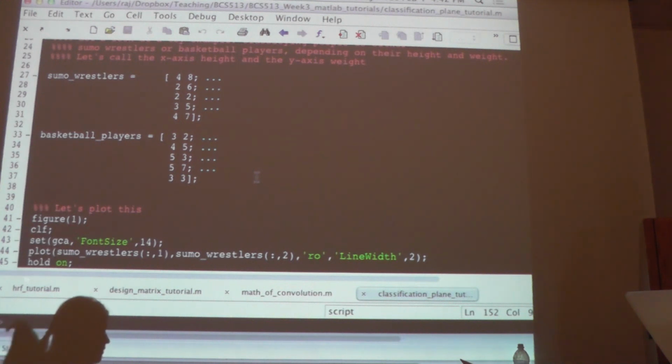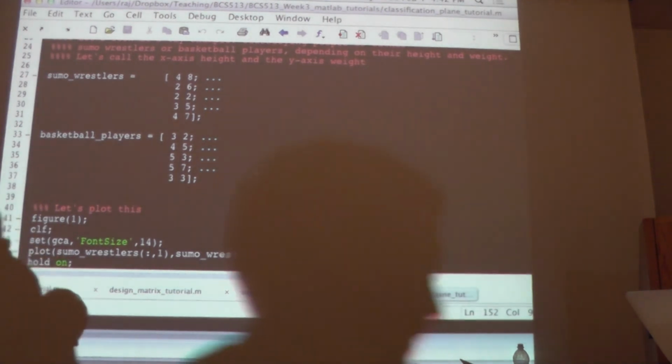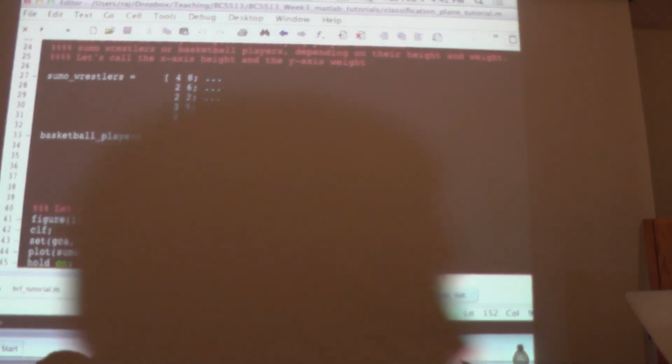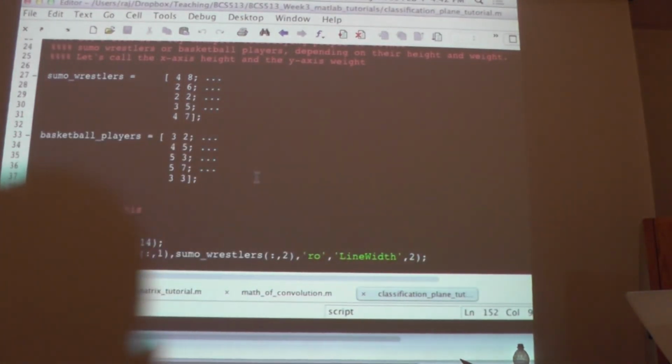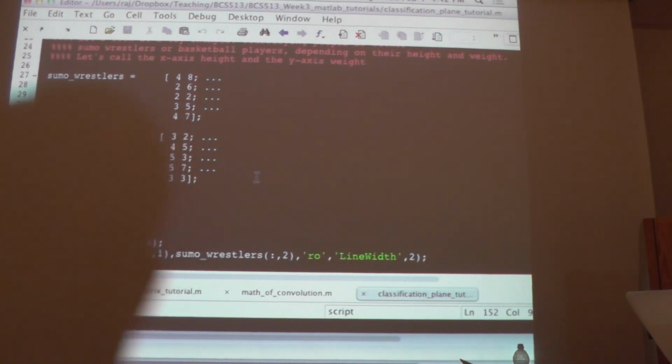Hey, I had a methodological question. About TRs: what is the logic, or why is it conventional to use a 2 second TR? Maybe not, but why do people use 2 compared to 4? Well, what you want is to get as much data as you can. In an ideal world, people could get away with a 1 second TR.